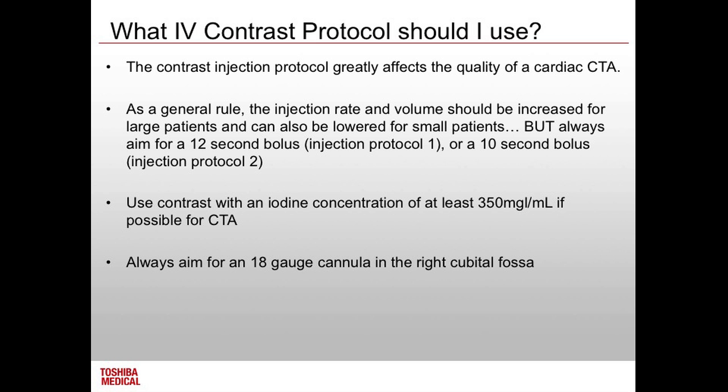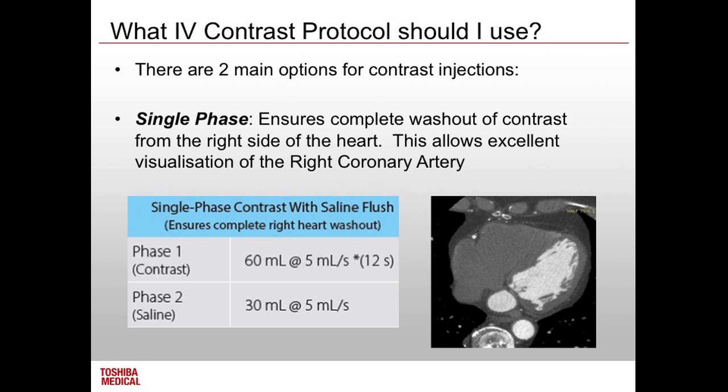I guess the important thing with IV contrast is you guys are all good radiographers and I'm sure you've done plenty of injections of contrast. I think really you need to know what you're aiming for when you're injecting contrast for a cardiac. And there's two real protocols we use. So this is what you'll use most of the time. And it's nothing fancy, it's just got a saline push.